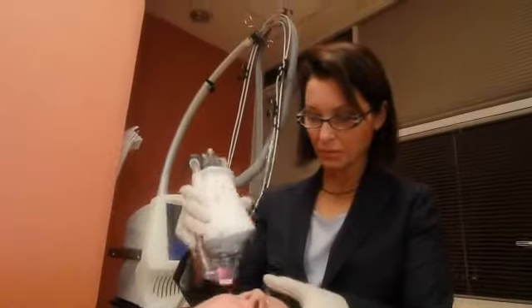When we do the thulium, our goal is a very superficial laser — it's not a deep laser, which is the beauty of it. Since it's fractionated and doesn't treat every little area of the skin, it heals rather quickly — it's a five-day healing process.